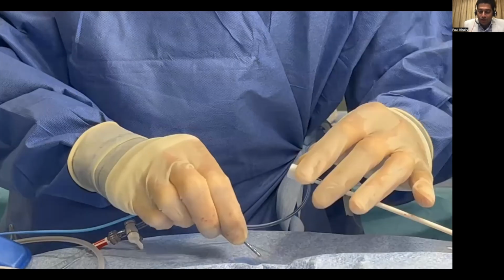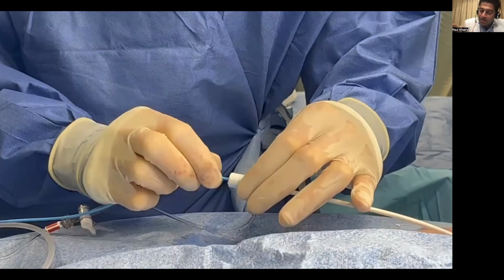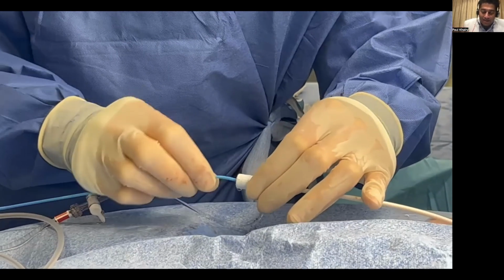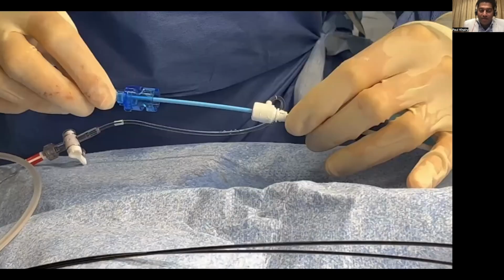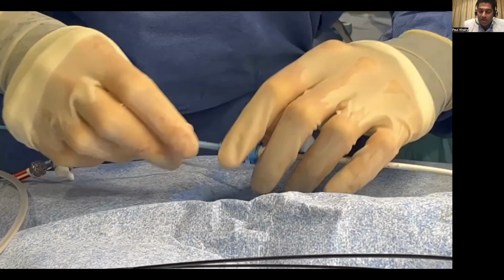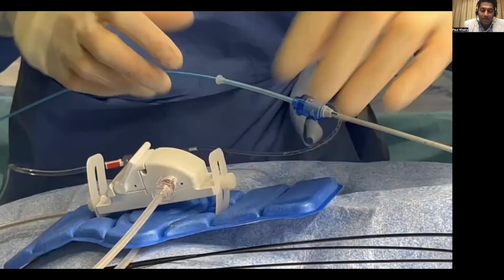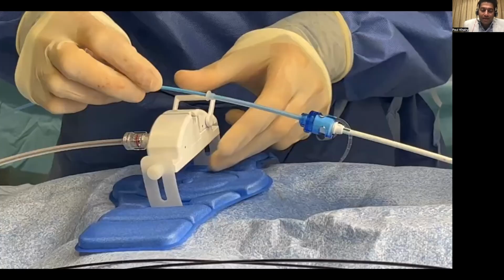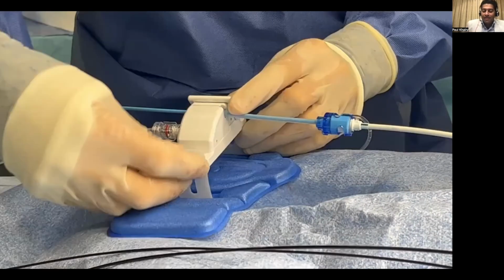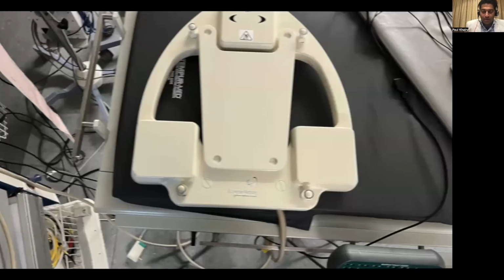And here, my fellow is placing our magnetic catheter through a connector, and I'll show you what that does. We're now flushing the catheter and then placing it in this long sheath, holding it close to the tip because it really is soft and flexible in order to get that into the sheath. And then that connector is locked into place to the sheath as shown here. And the proximal portion of the connector is then locked into place in this little motor called a Cardio Drive that allows us to advance and retract the catheter at a distance using that scroll wheel of the mouse.